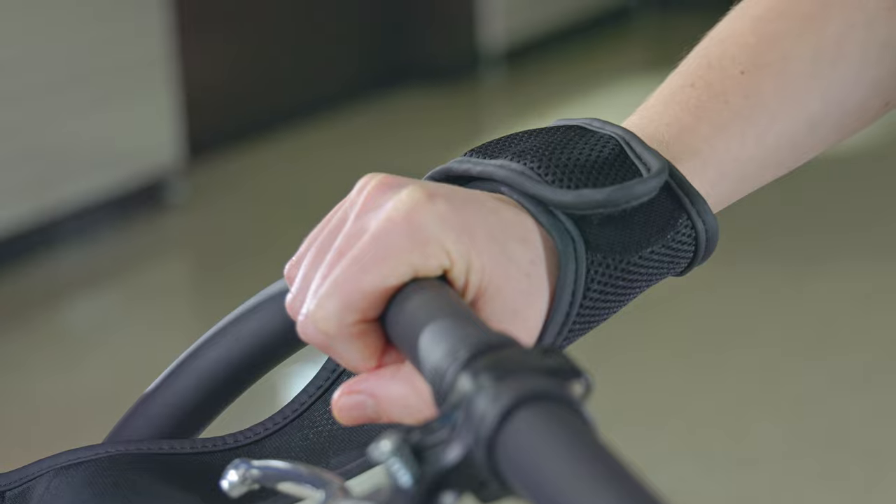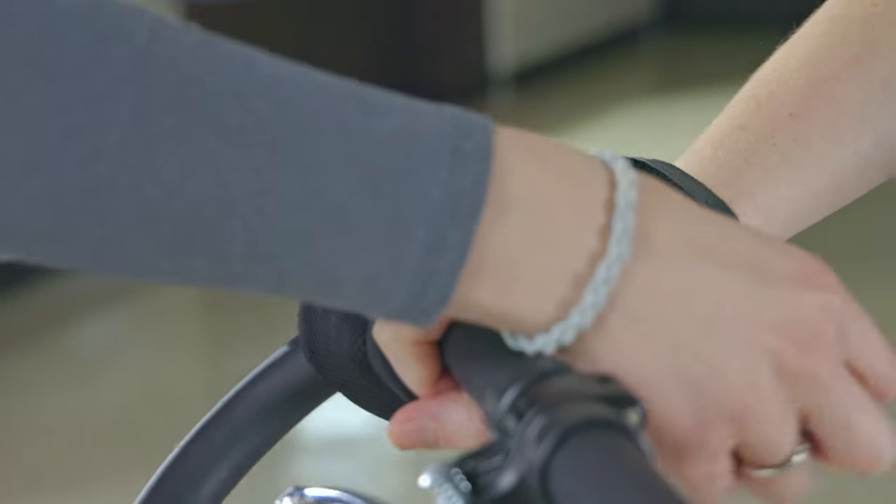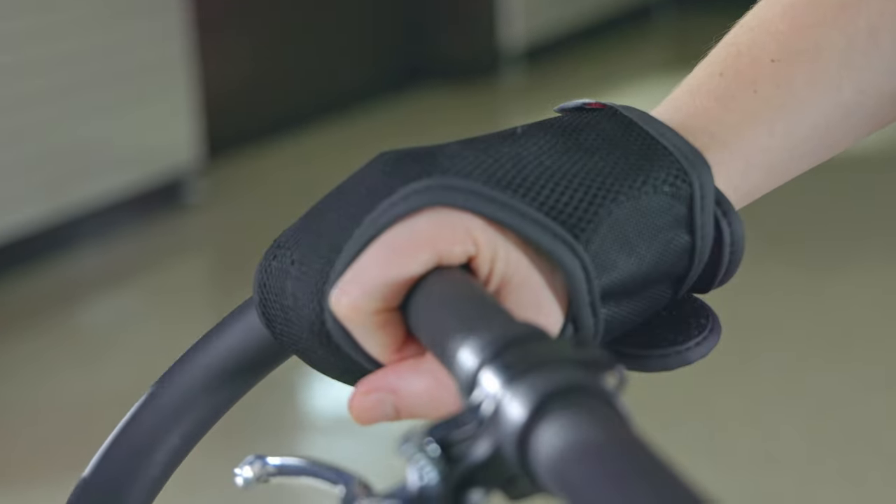For riders who have difficulty maintaining their grip on the handlebar, we can use this comfortable hand anchor. We secure one end around the individual's wrist and bring the anchor up and over to secure the other end. This holds the hand onto the handlebar in the gripping position, and we can use it on both styles of handlebar.